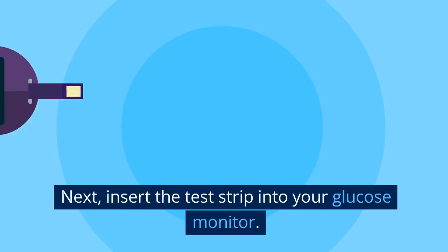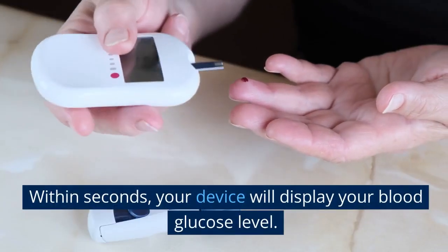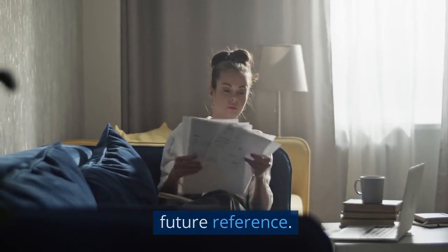Next, insert the test strip into your glucose monitor. Within seconds, your device will display your blood glucose level. Make sure to keep a record of your readings for future reference.